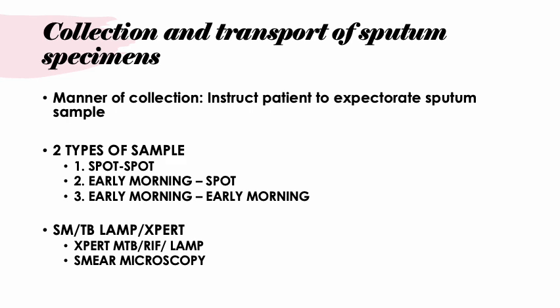Usually, the first submitted specimens are processed for patients that are first-time suspected with TB. Okay, so 2 to 3 specimens should be submitted, and these specimens usually are early morning specimens. In terms of rapid detection, we can use molecular techniques such as using Xpert or TB LAMP machines for quick detection.